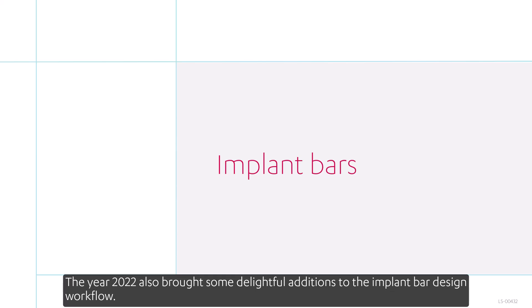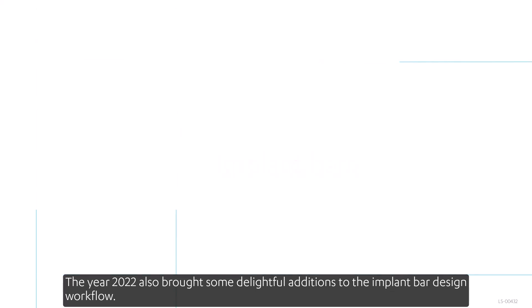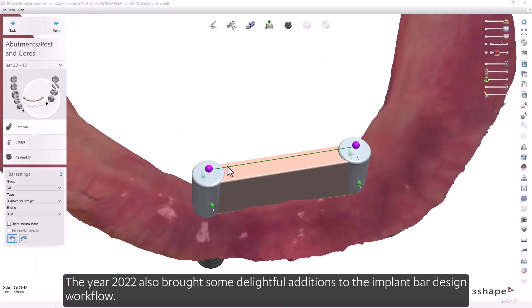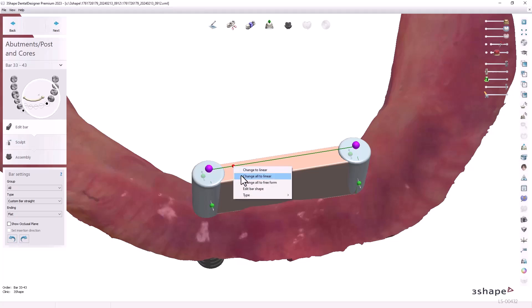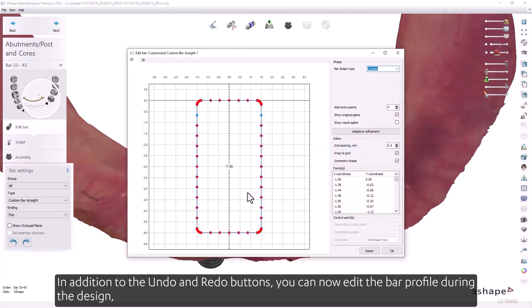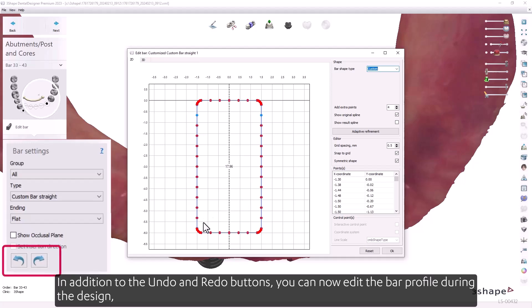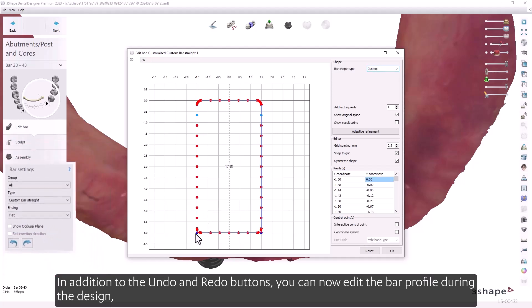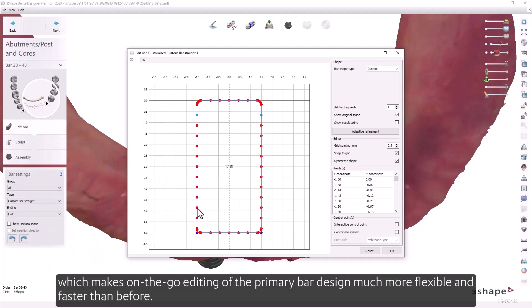2022 also brought delightful additions to the implant bar design workflow. In addition to undo and redo buttons, you can now edit the bar profile during the design, making on-the-go editing of the primary bar design much more flexible and faster than before.